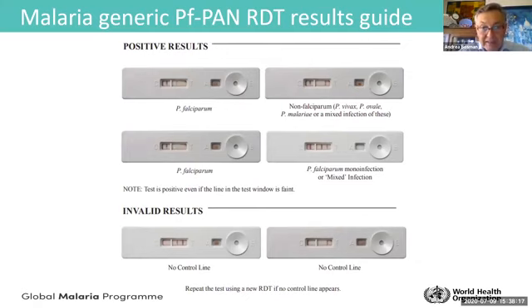So if you have a doubt, and you have Primaquine available, then it may be good to check with a microscope and somebody who can really make a diagnosis of mixed infection. You probably need to send it to a good lab to make this analysis.